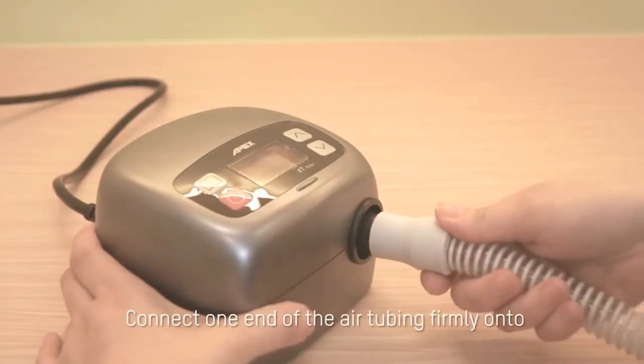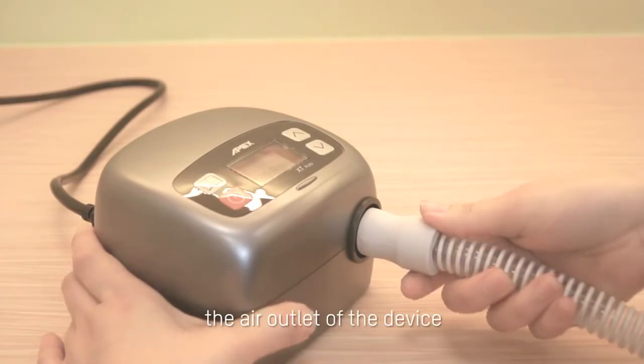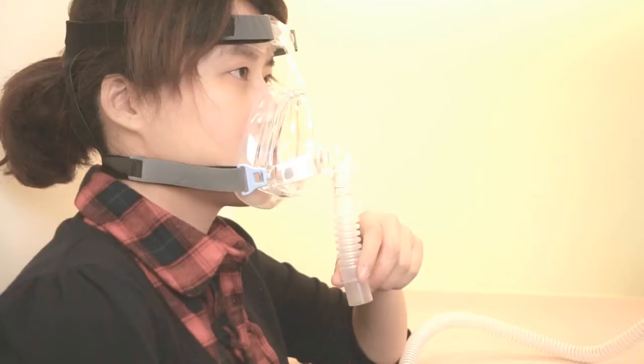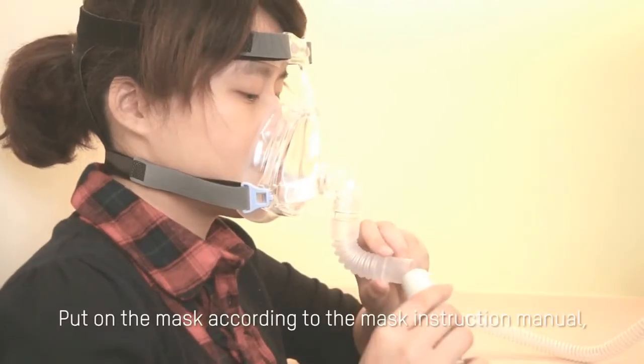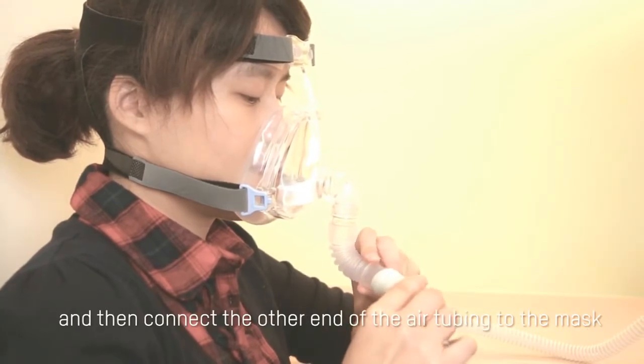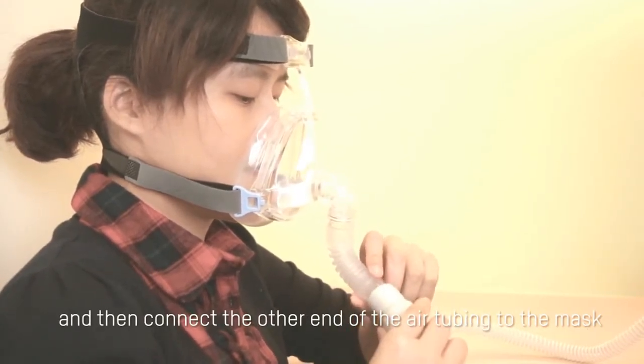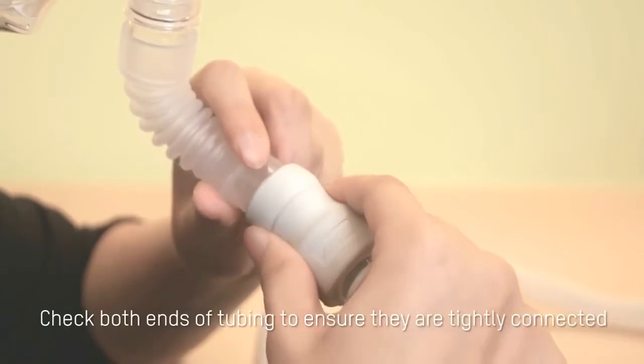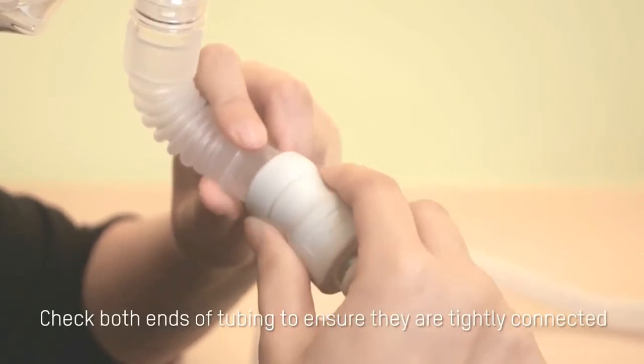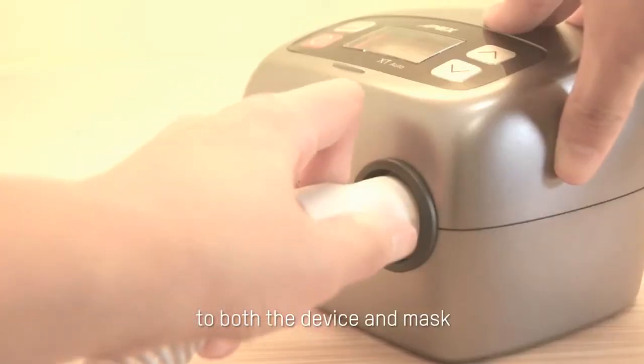Connect one end of the air tubing firmly onto the air outlet of the device. Put on the mask according to the mask instruction manual and then connect the other end of the air tubing to the mask. Check both ends of tubing to ensure they are tightly connected to both the device and mask.